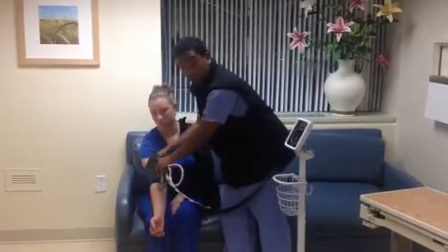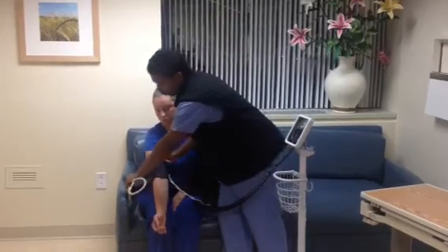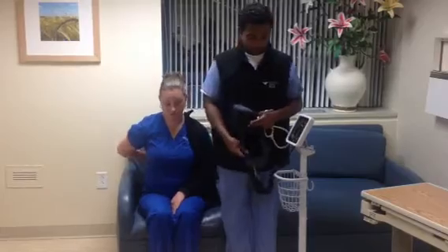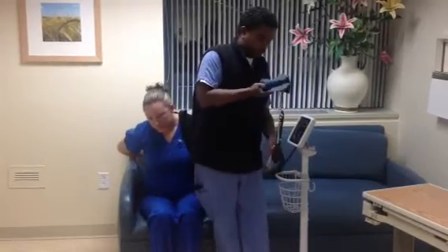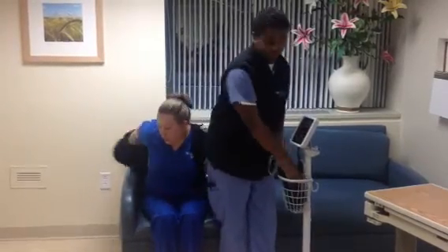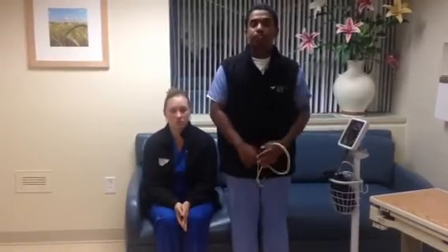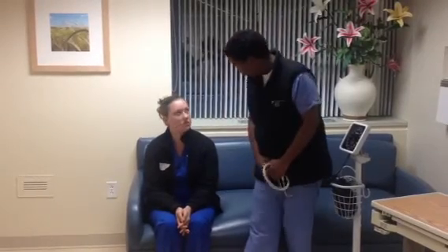When you're done with doing a blood pressure, you may remove the equipment, have the patient put the jacket back on, and properly put away your equipment. This concludes my presentation on taking a proper blood pressure, and thank you very much for your assistance.